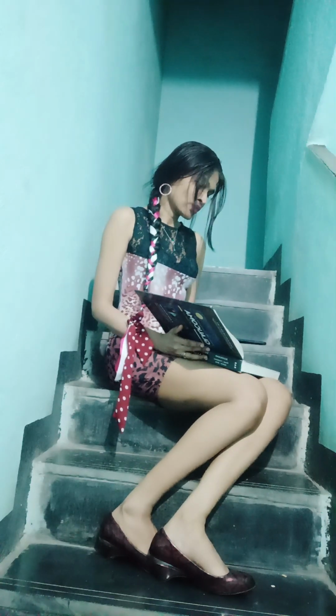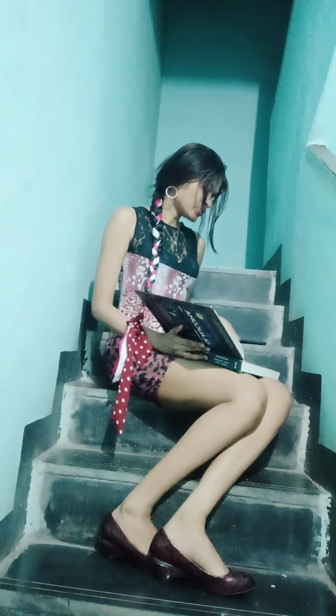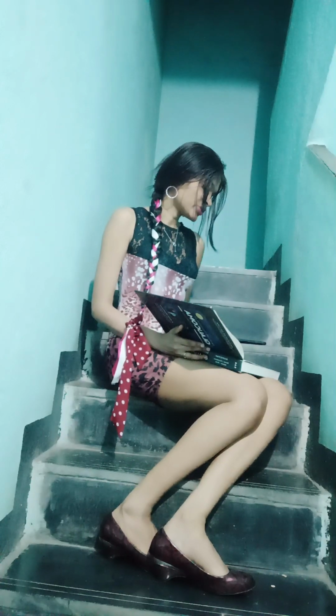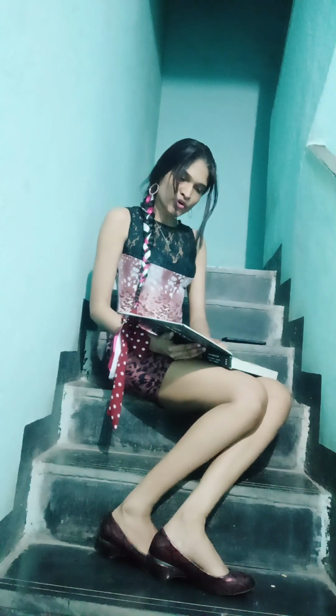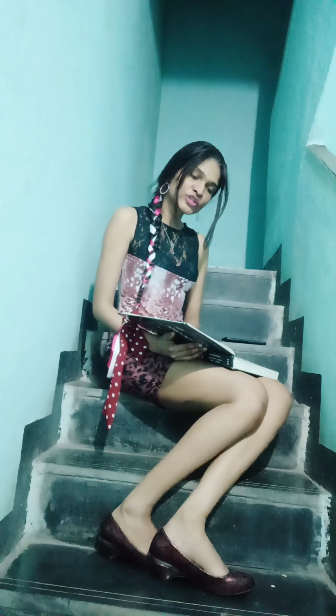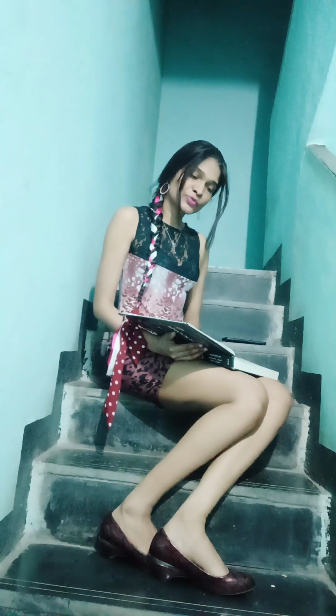Now the technique of indirect gonioscopy. The cornea is anesthetized, and with the patient positioned at the slit lamp, the gonio prism is placed against the cornea with or without a fluid bridge depending on the posterior radius of curvature of the instrument. The lens is then rotated to allow visualization of all 360 degrees of the angle, or the quadrants are studied with the four mirrors.